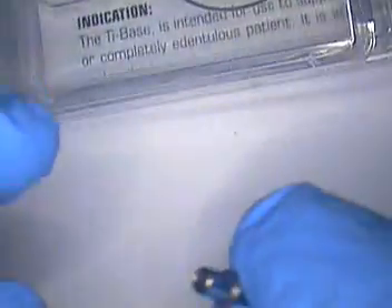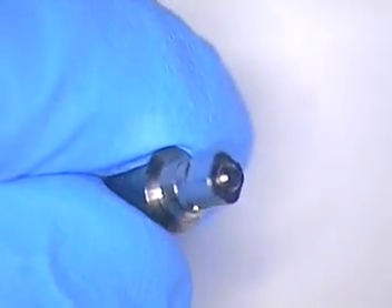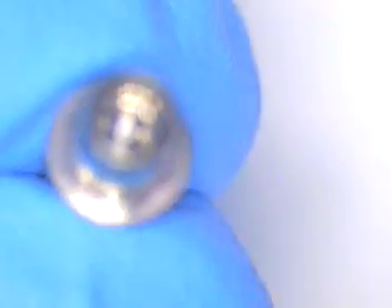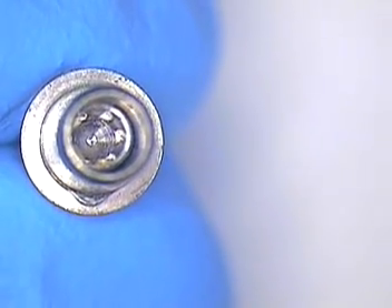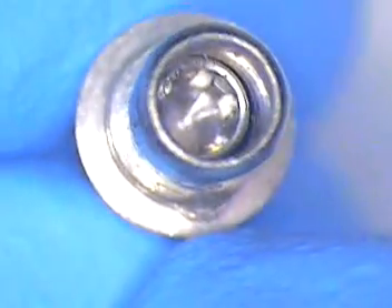NT Trading makes a titanium base that's used to support these types of crowns. The lab likes this particular one over regular stock abutments because it has the configuration for the Straumann on one end with the screw. It has this platform that you can scan continuously and replicate. It has just one anti-locking — a little nipple that comes off the side — and that prevents rotation when you go to reseat this to cement it in place.